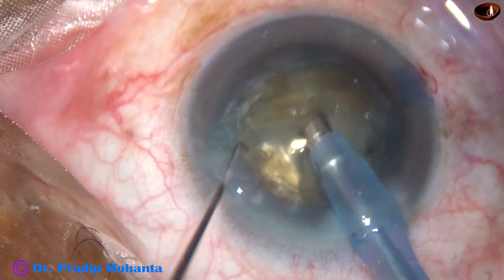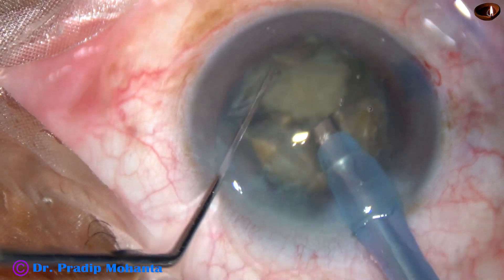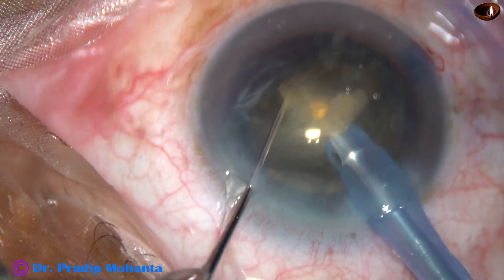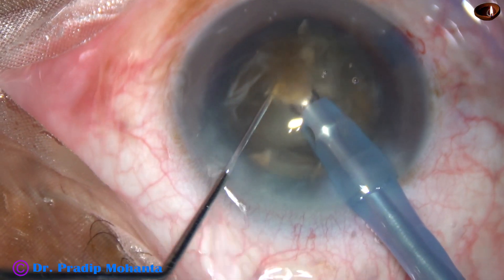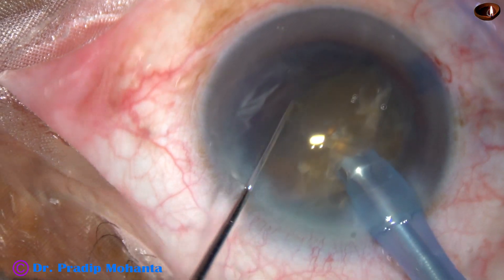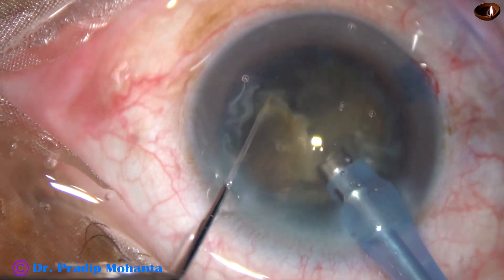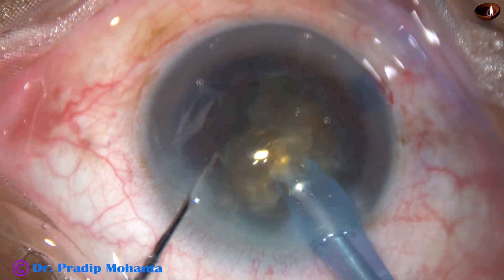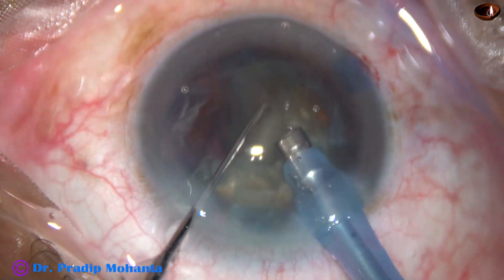A fragment is selected — the apex is attacked first and then the rest of the piece is emulsified. The rest of the piece is divided into two smaller pieces if necessary, and then it is removed.